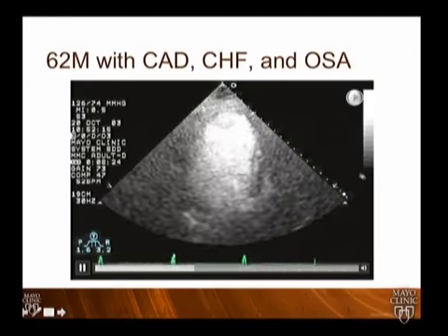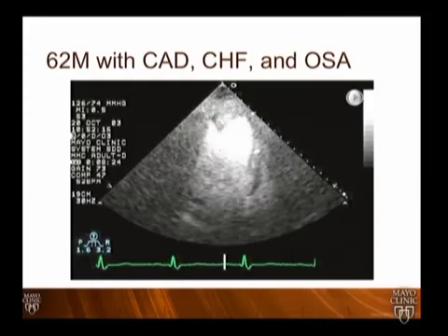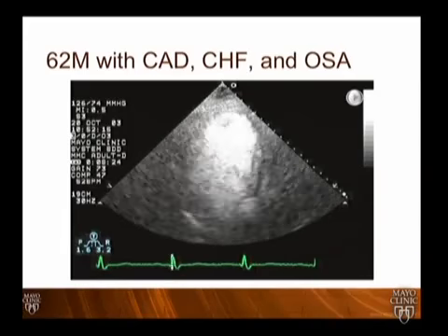So everyone was thinking the right way there. I kind of tricked you. And the way the question would be framed is that it would probably ask you, one of the options would be administer contrast to identify this.